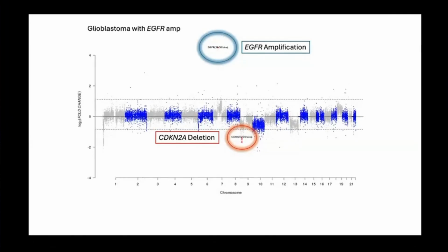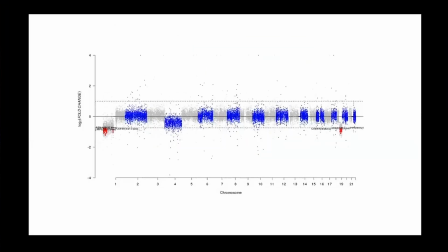It's not a typical thing for these oncology panels to have calling thresholds and reporting criteria for all these other chromosomal alterations, most of which are of uncertain significance. But some of them really are important.